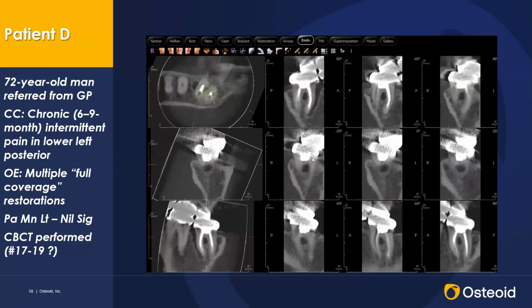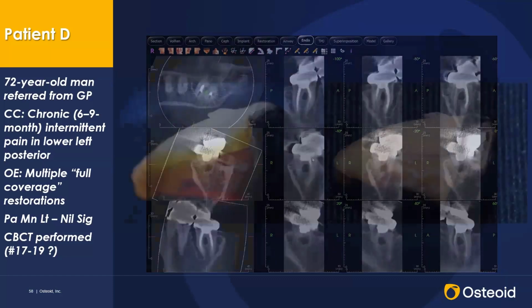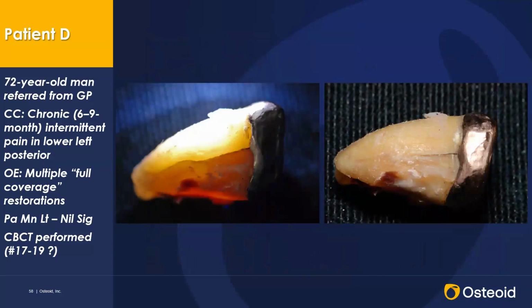We can see what seems to be a fracture of that mesial root. Well, the tooth was extracted and confirms our diagnosis. So using this particular modality, cone beam CT, high resolution, small field of view, and using the appropriate imaging tools systematically has helped me enormously in the last 10 to 15 years get the maximum out of cone beam CT.